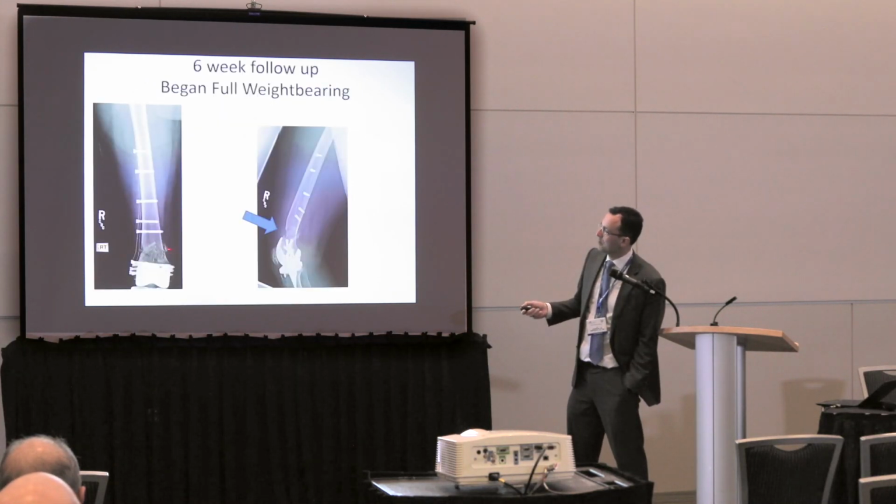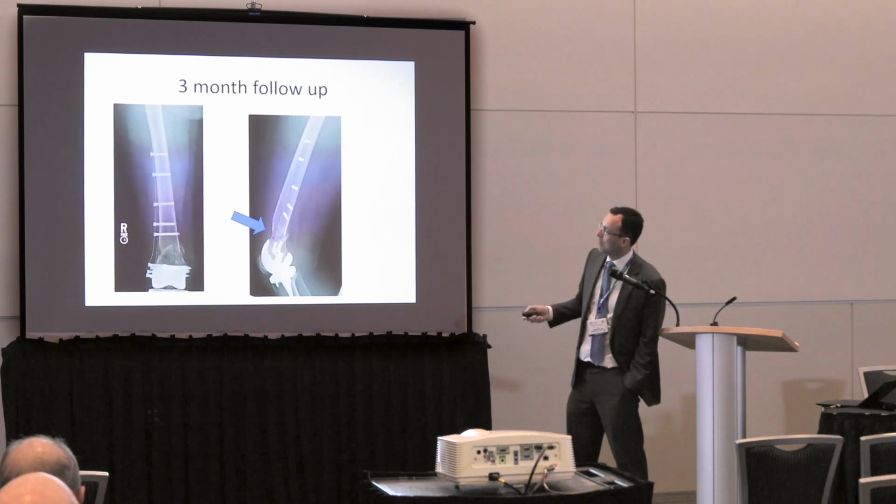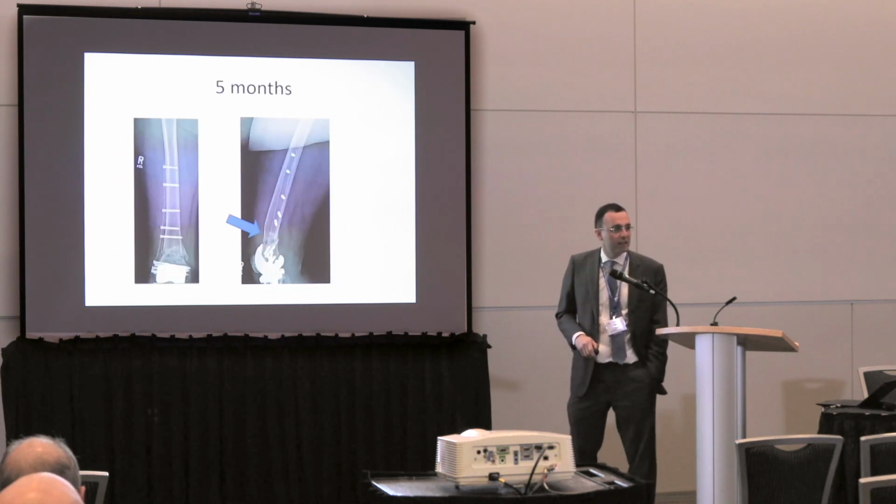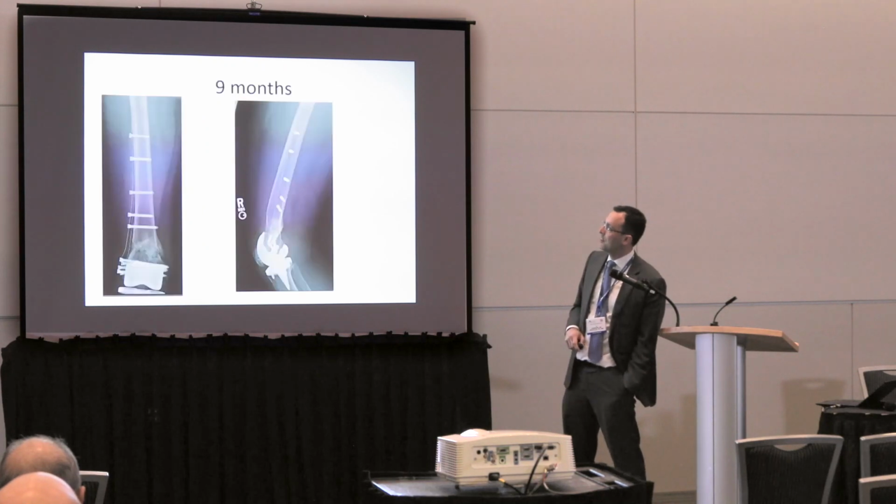And look at, there's some callus, and then there's something forming there. I want you to just focus on that. 3-month follow-up, more bone, and here she is at 5 months. Again, just amazing healing. And 9 months, and that was it.